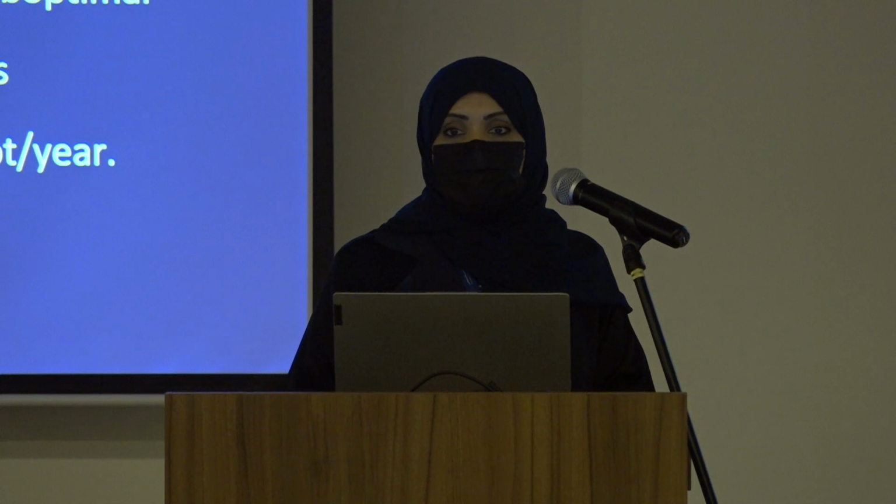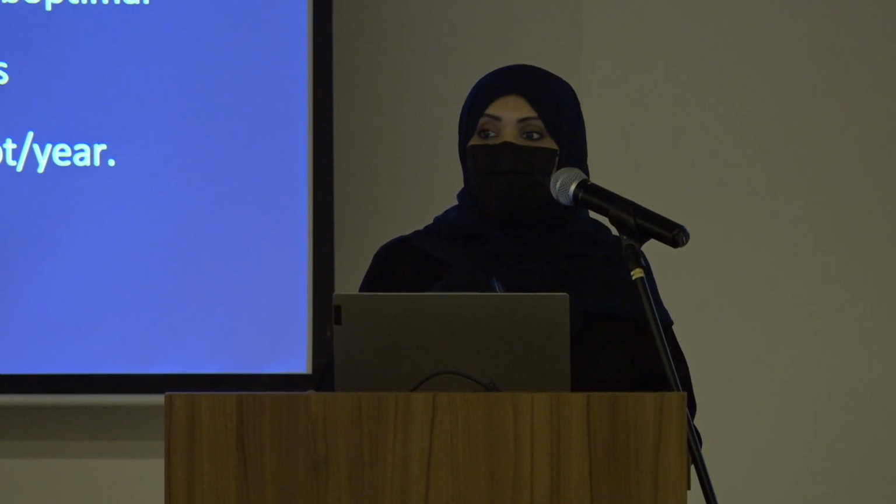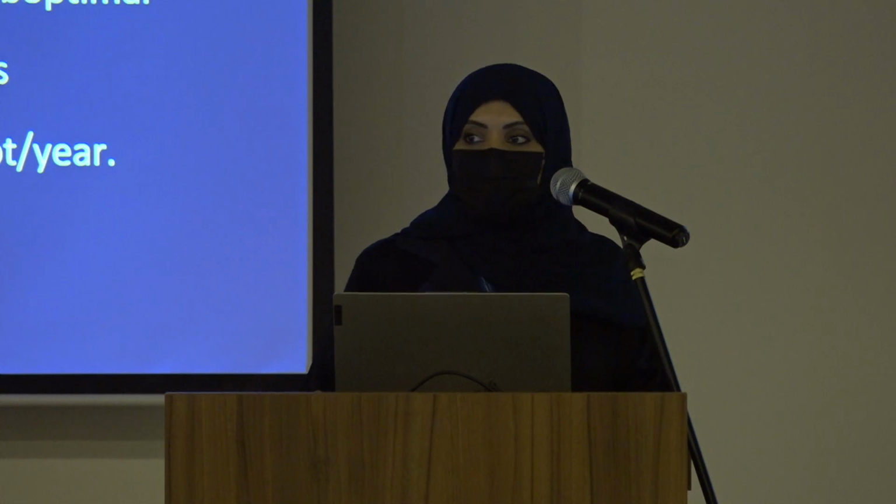So whenever we pick up and make a quick diagnosis, putting the patient on the right path, then we are going to do a consultative echo by a dedicated specialist of ultrasound. Thank you very much.